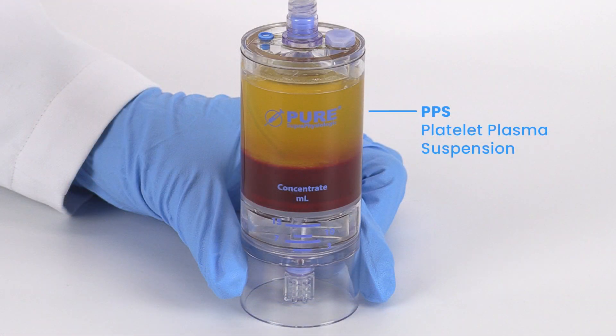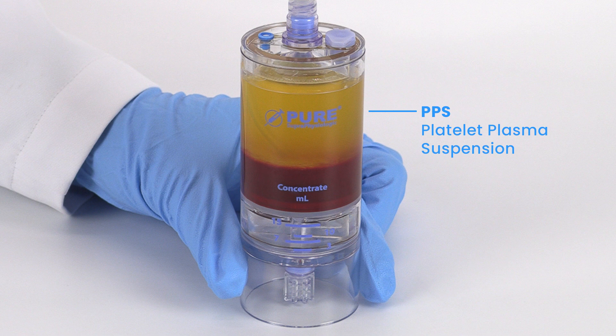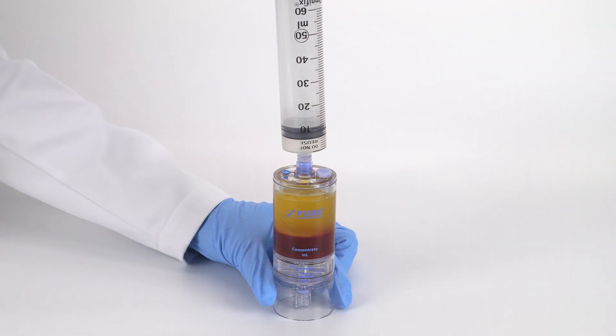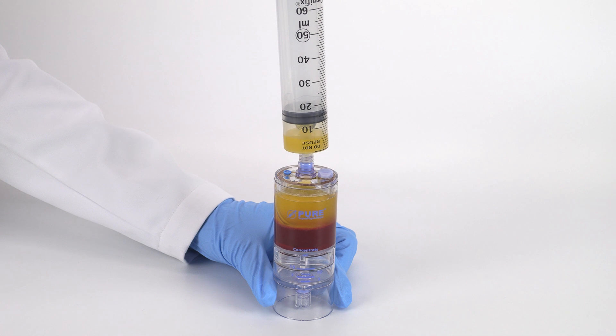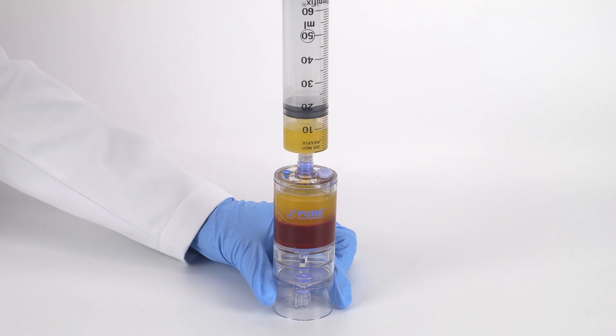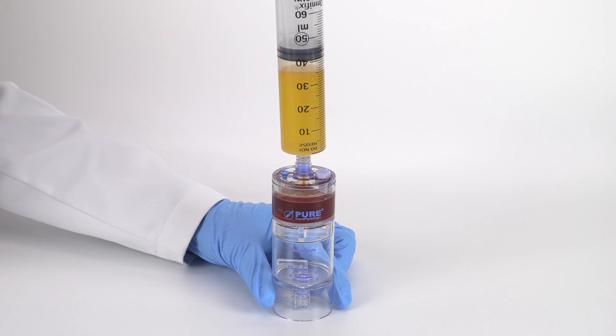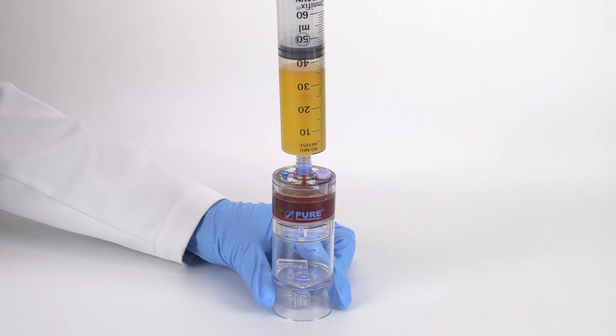After centrifugation, the platelet plasma suspension, or PPS, will be separated above the red blood cell layer. Attach a sterile syringe to the top port and aspirate the platelet plasma suspension. Platelet recovery is improved by collecting a small flash of red blood cells equivalent to approximately 0.5 milliliters.